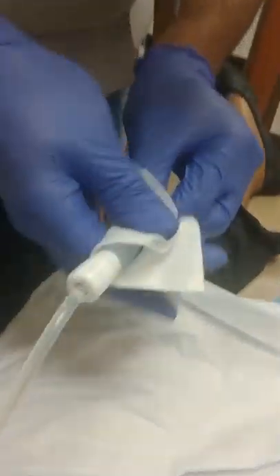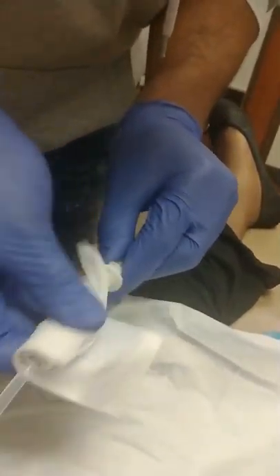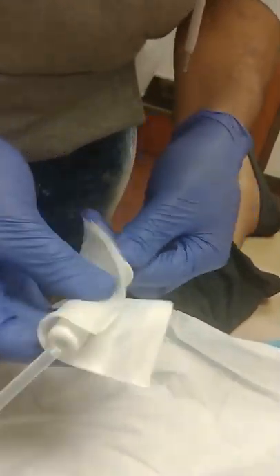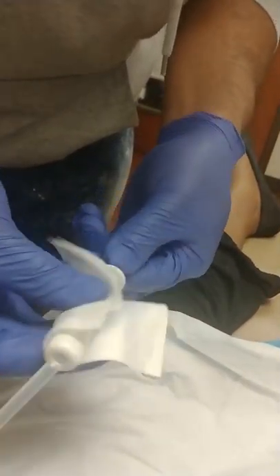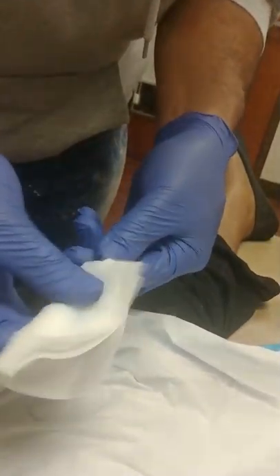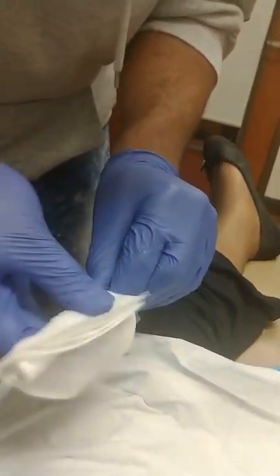Yeah, you have to scrub this for like a minute. You have to get it really clean, really sanitized. And once you open it, you cannot touch the tip with nothing. Absolutely nothing but the cap. We also closed the vent over there. Yeah, we had to close the vent.